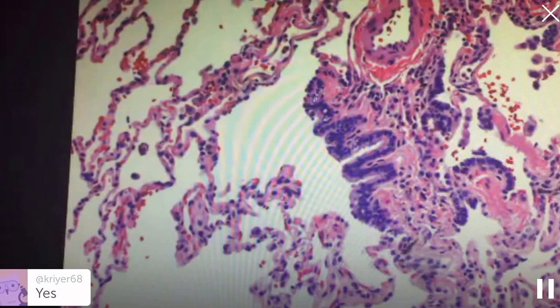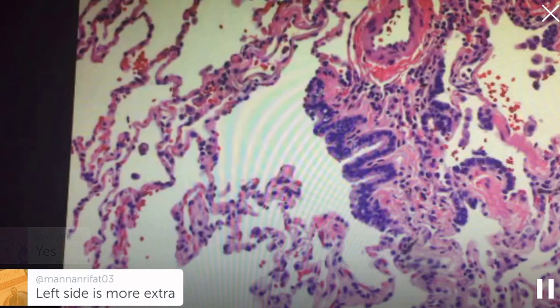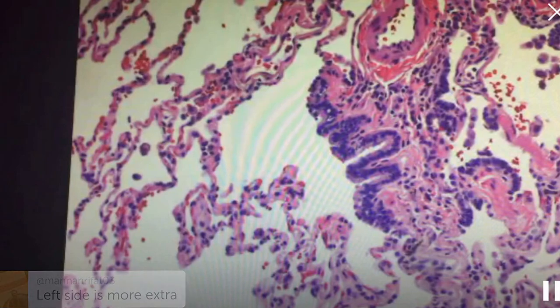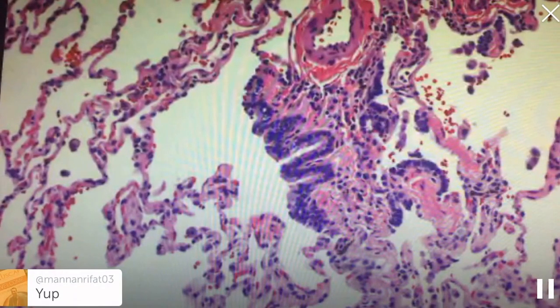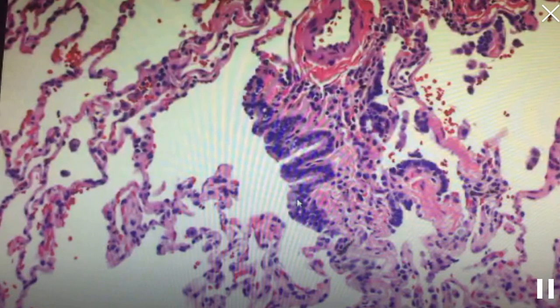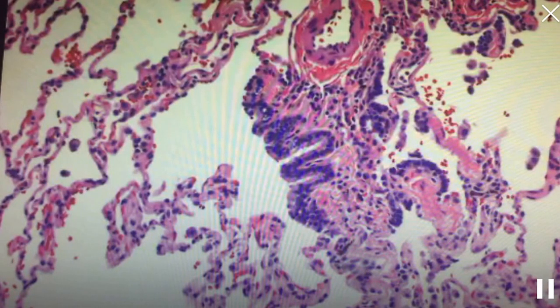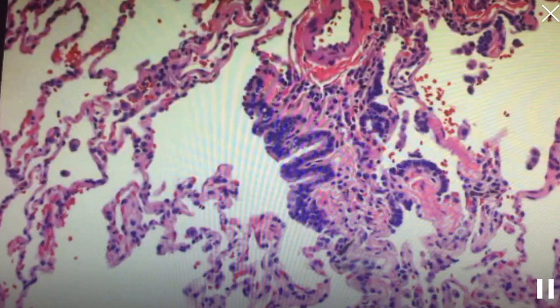So what we've got here — does anybody know? Riffat, do you know, or Kalyani? What is this structure that I'm so enamored by? There is a small blood vessel here and then there's a thing next to it. So in the lung, there's always a blood vessel and something that runs together. This is actually called a bronchovascular bundle, and the structure that I am really enamored by is this thing called a respiratory bronchiole.